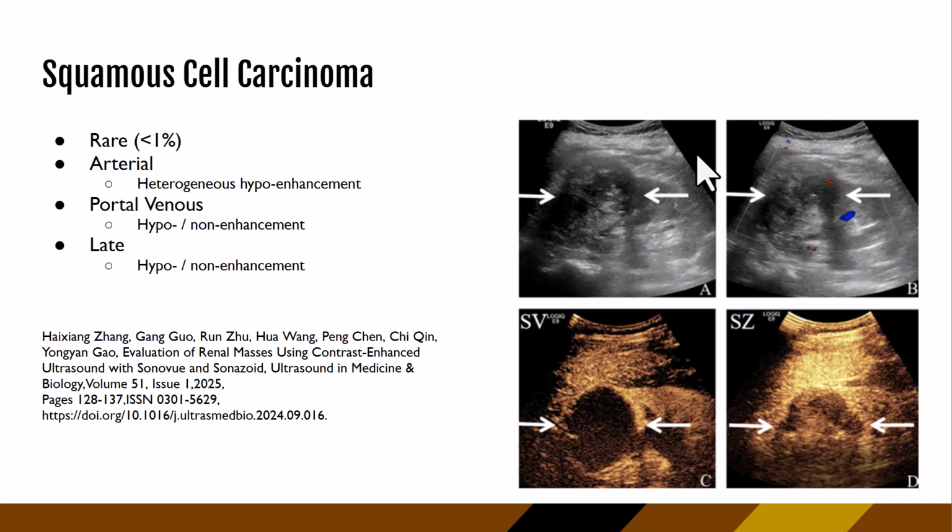So looking at A here, we are seeing on grayscale ultrasound, the lesion appears kind of isoechoic, without real strong borders, but we can tell there's something chunky going on up here. But nothing really obvious that's like, oh, that's definitely a cancer, but we're definitely concerned about it.